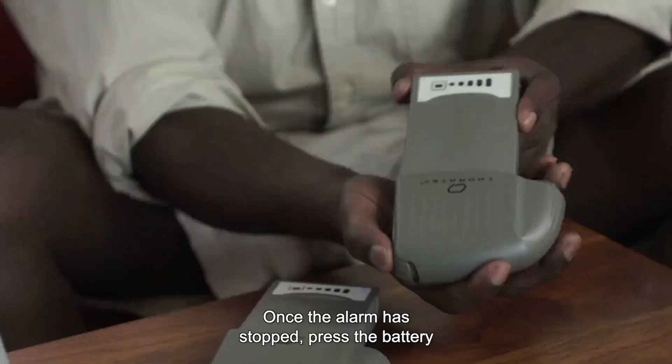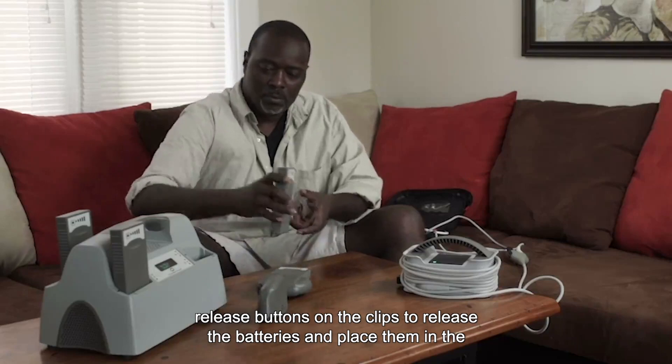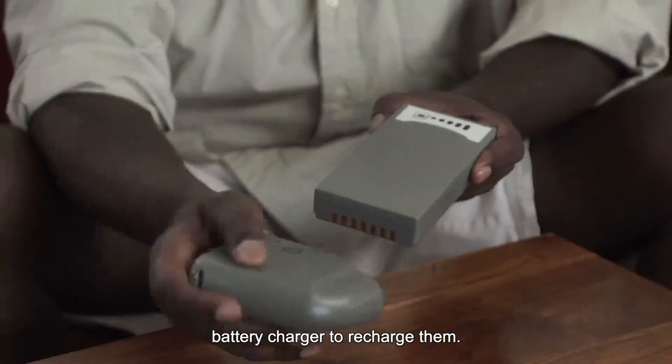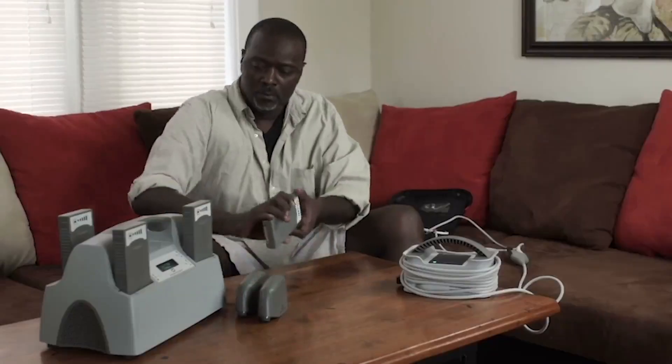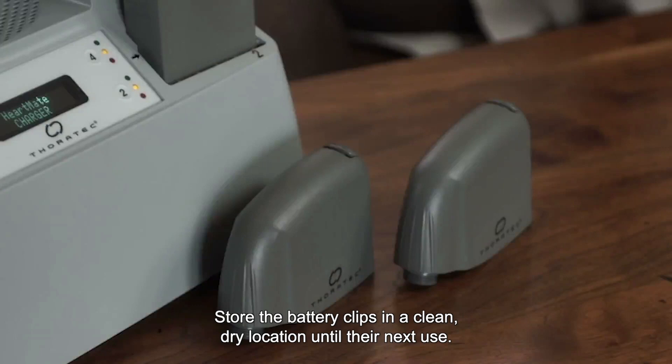Once the alarm has stopped, press the battery release buttons on the clips to release the batteries and place them in the battery charger to recharge them. Store the battery clips in a clean, dry location until their next use.